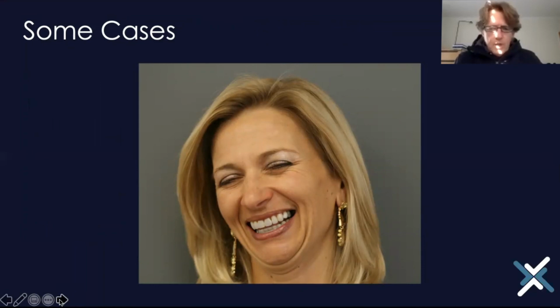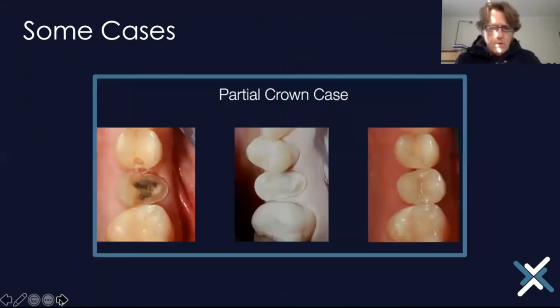Those crowns are all done by chairside mechanism. So let's look at a partial crown case. On the picture on the left here, you will notice the palatal is overlaid. The dentin here is sclerotic. However, the pulp is protected. The margin over there, which is to mesial, was below the soft tissue line, and the intraoral scanner wouldn't be able to pick that margin up unless you have taken the soft tissue away.